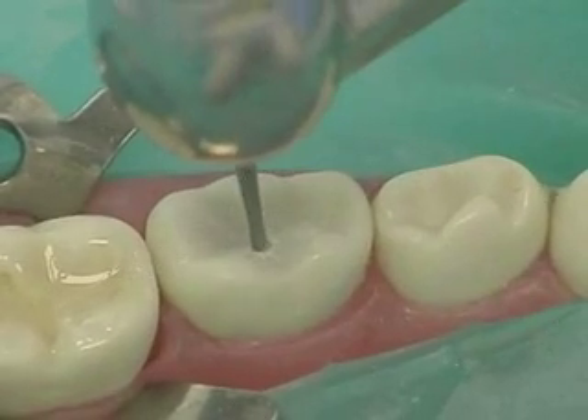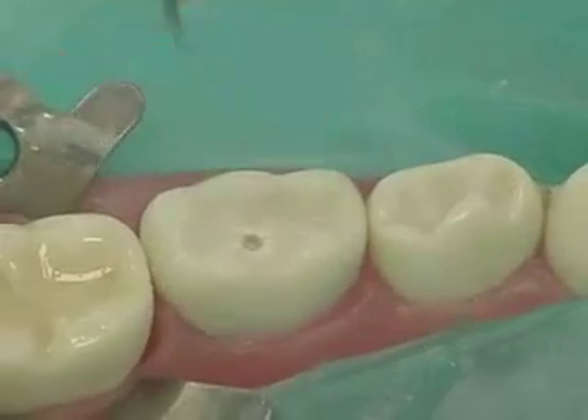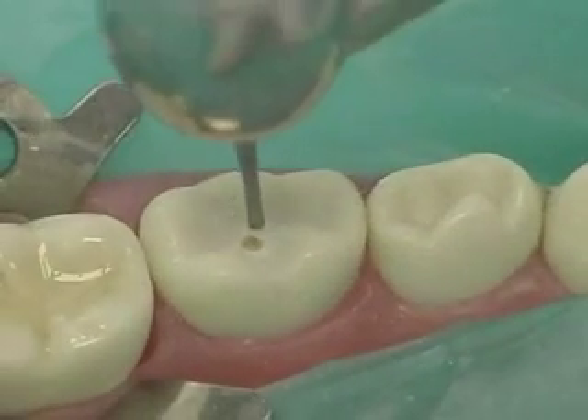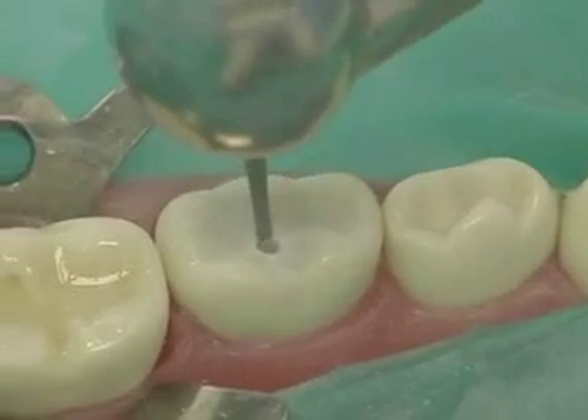Make the initial preparation cut in the central fossa using a 330 burr. The depth cut should be approximately 1.5 millimeters. This burr measures approximately 1.75 millimeters.